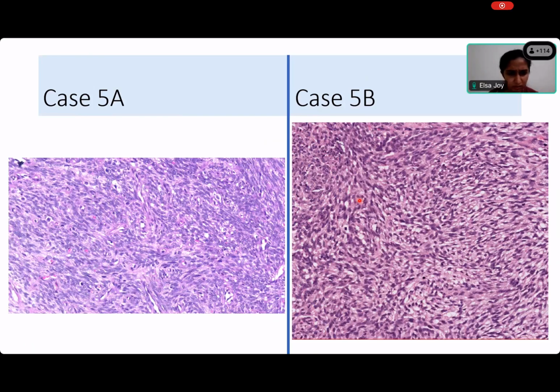What did we say when we have to see spindle cells apart from the pattern? Now we have honed down on the cells. We have to look at the cells. That's why we went into the story of cells, pattern, matrix. So now tell me, we saw matrix in the neurofibroma. We saw matrix in the schwannoma. We saw matrix in the nodular fasciitis. Yes. Now tell me about the matrix over here. People have been forgetting the matrix.